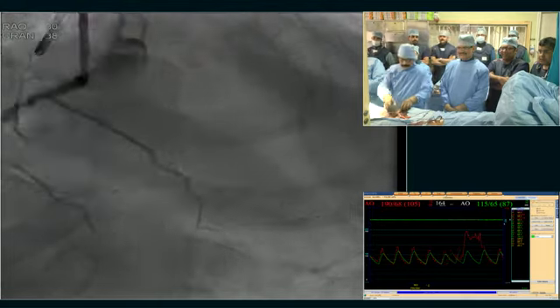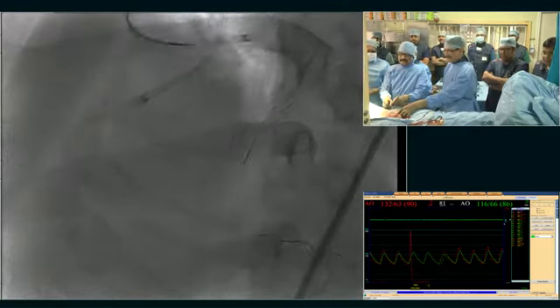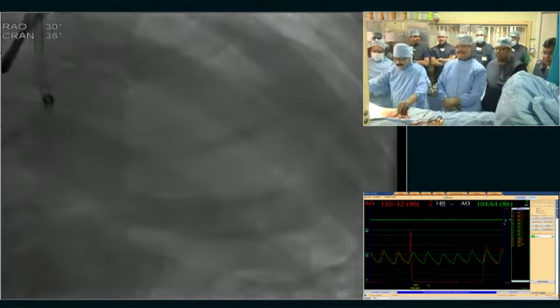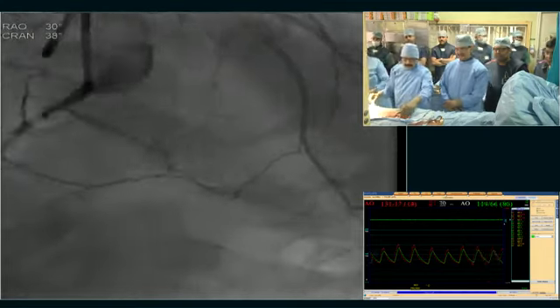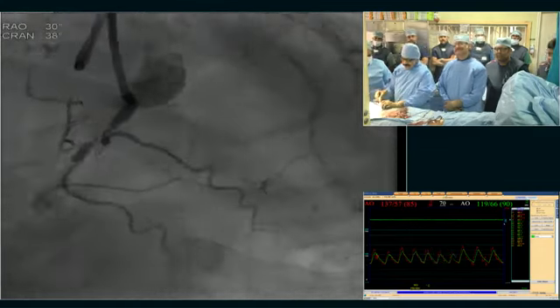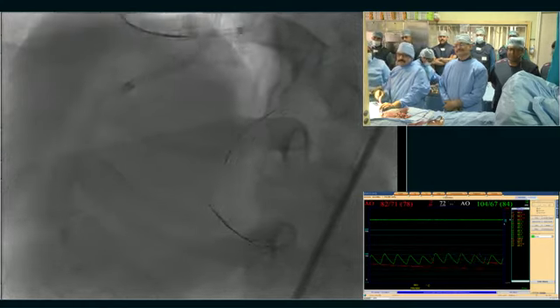Thank you so much for being with us. So we saw the diagnostic angio, and it's an instent CTO. The stent is going close to the crux? Just beyond the bifurcation. We lost the PLV in the ISR, which is retrogradely filling from the left system. The PDA, just beyond the bifurcation, is filling.